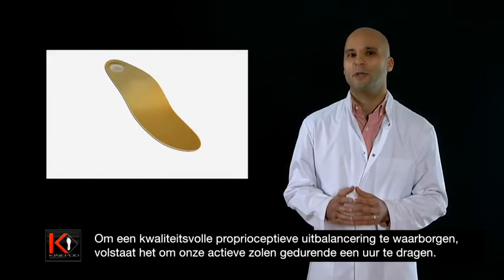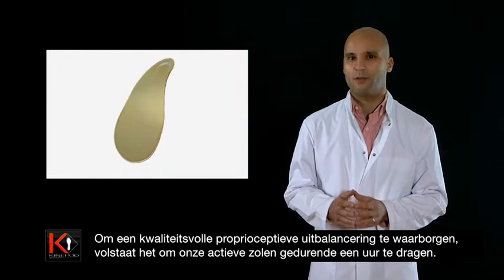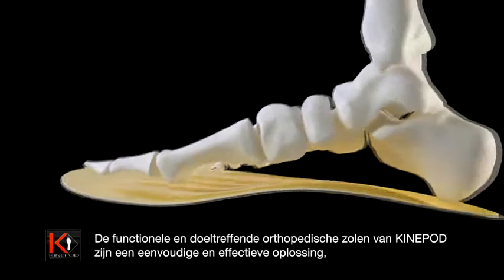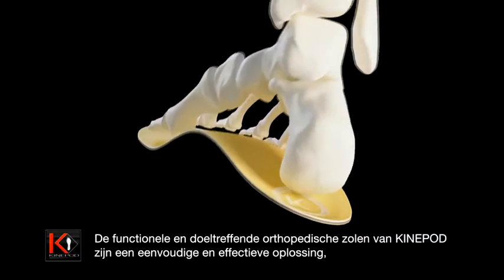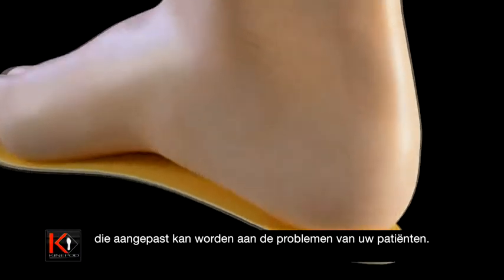To ensure quality proprioceptive equilibrium, wearing our active soles for one hour is sufficient. Kinopod orthopedic soles are functional and active, offering a simple and efficient solution that can be adapted to your patient's problems. Don't hesitate to propose them straight away.